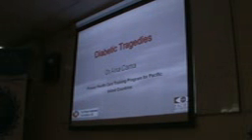And if they do need laser, you can take the photo before the laser, and you take it again after the laser is completed. Sometimes if vision does not improve, you can actually see the evidence on the photo that while the diabetic retinopathy has improved where you have lasered, it's started again somewhere else. That is why vision is still the same or it has gotten worse. Okay, so photos have that advantage. You can recall them, you can bring them back next month, next year for comparison. You can even use it to educate the patient and their family.